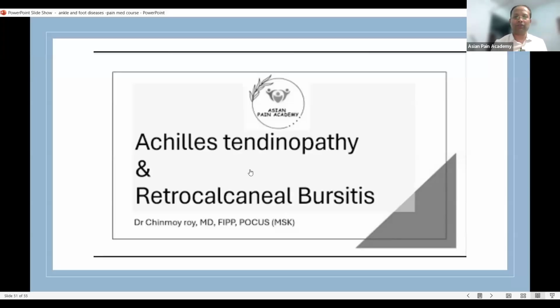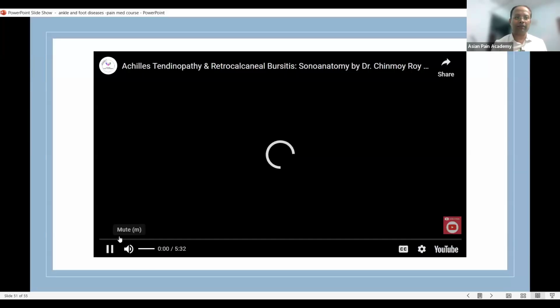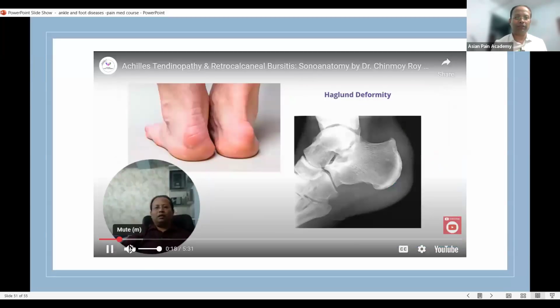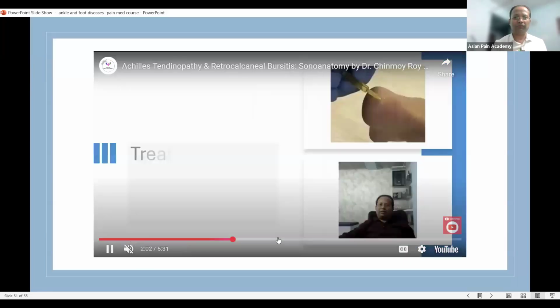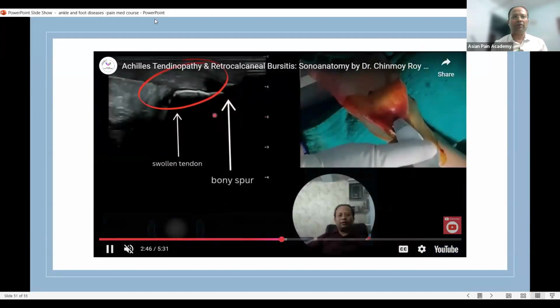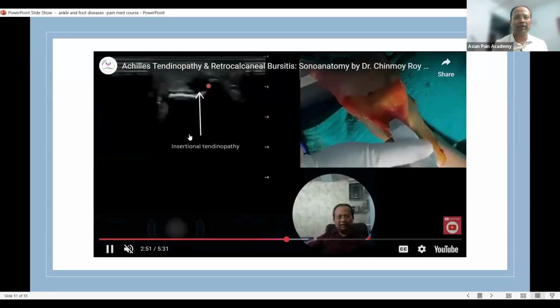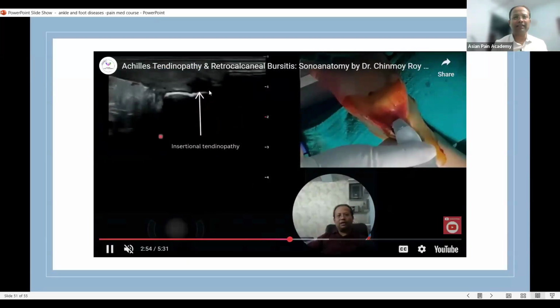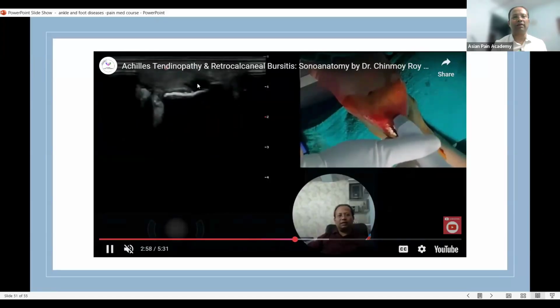Achilles tendinopathy. This one you will find on YouTube, this video. Just a minute, I show it. So you can see this video. You can see this is the insertional tendinopathy. This is the area. Some retrocalcaneal bursa effusion is also there.